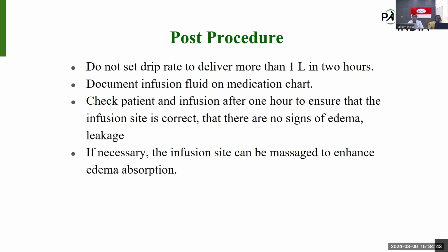Then check the patient and infusion after 1 hour to ensure that the infusion site is correct and there are no longer signs of edema and leakage. The principle of action in subcutaneous infusion is diffusion, and this is the movement of molecules from higher concentration to lower concentration, and it will take some time.